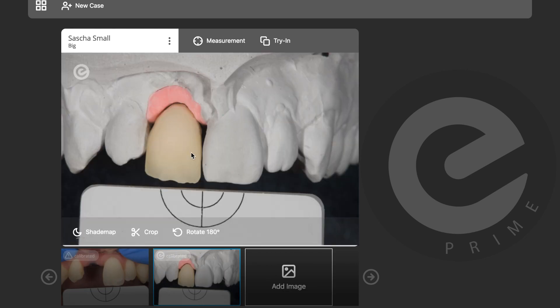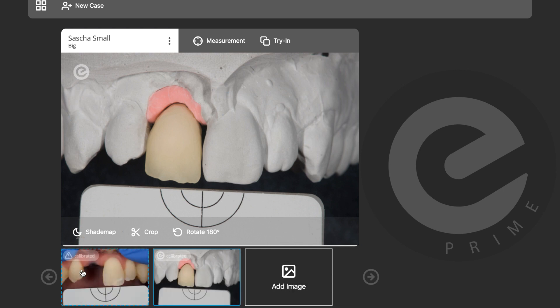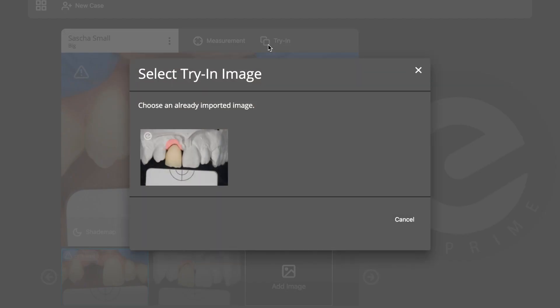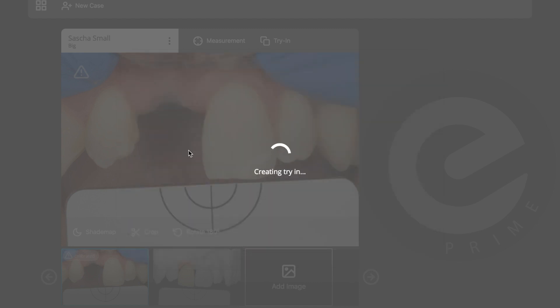This is my fired tooth and I can now do a digital try-in. This is the beauty — you don't really have to do anything. You just go back to the main picture and click the 'Try In' button. Select try-in image, choose an already-imported image — this is the calibrated picture I just calibrated — and click on it.